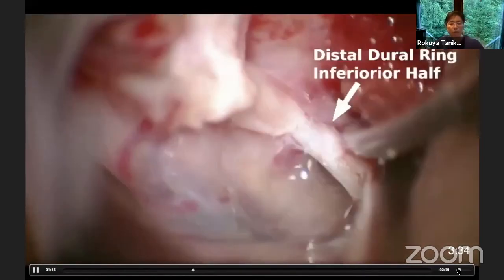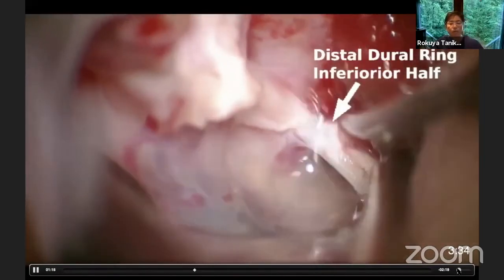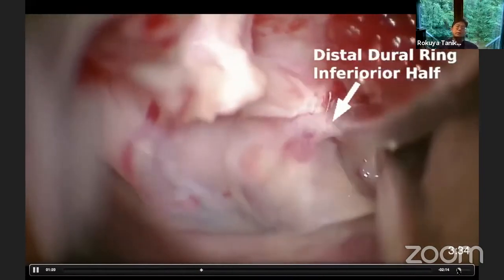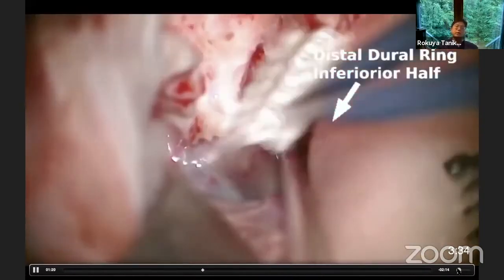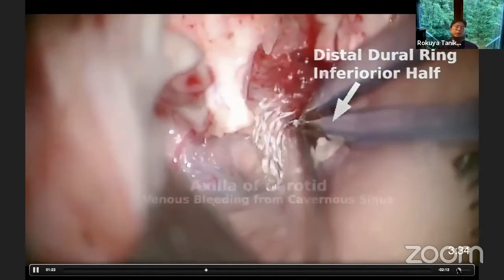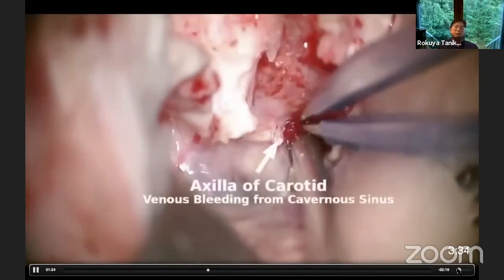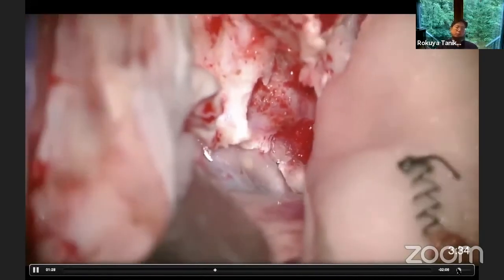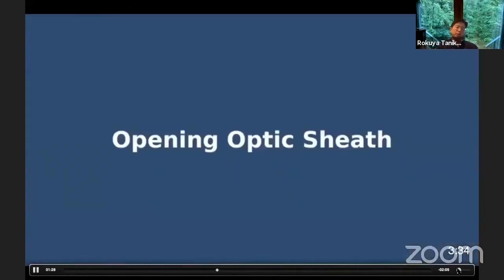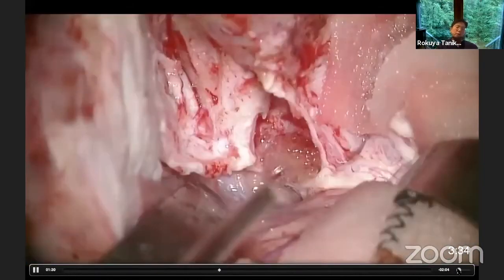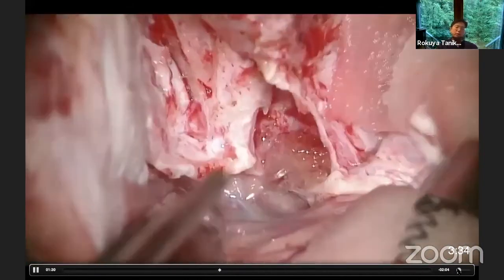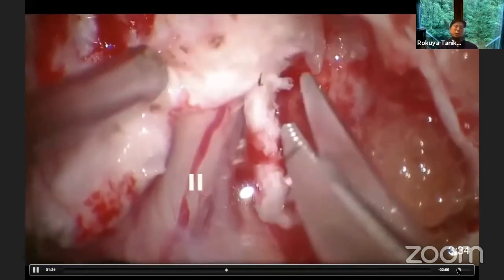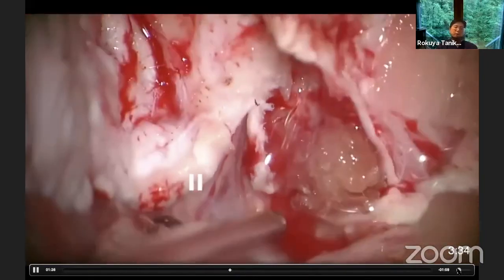By incising the frontal dura toward the optic sheath, you can find the distal dural ring attaching at the C3-C2 junction. By opening the carotid oculomotor membrane, we encounter venous bleeding from the cavernous sinus. You can control it with a Surgicel or Gelfoam pack.